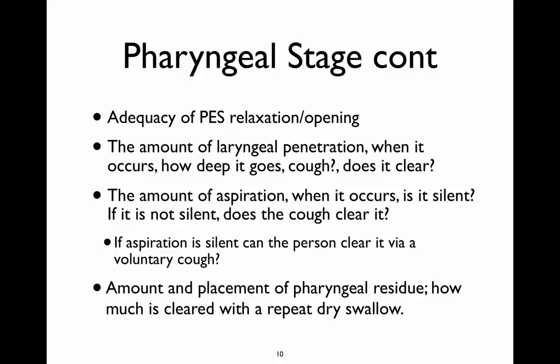You're also going to be able to do the same thing that you did in a FEES assessment, and that is if you see pharyngeal residue, or even oral residue, you're going to see how much they can clear if you have them do a repeat dry swallow. This is also called double swallowing or a second swallow.